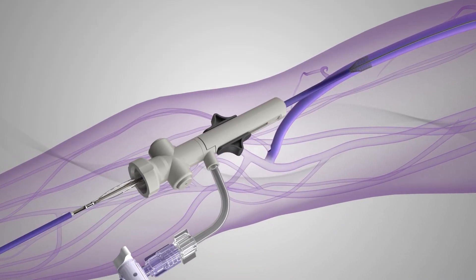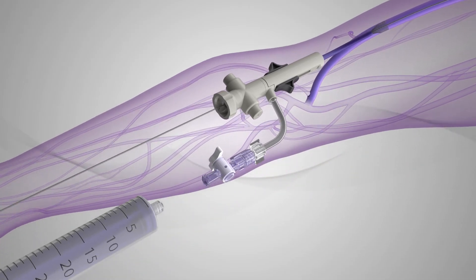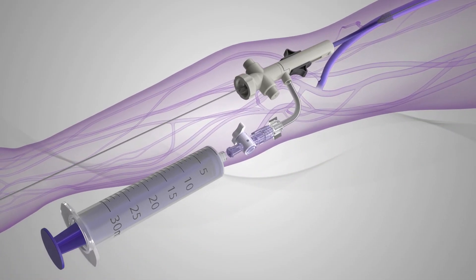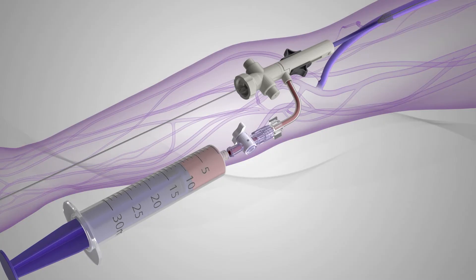After the Inthril catheter is withdrawn from the patient, the valve buttons are released to minimize blood loss. Then, aspiration is performed to remove any residual clot from the sheath by connecting a standard 30cc syringe to the sheath's aspiration side port until free flow is observed. The sheath's side port stopcock is closed and the 30cc syringe is removed.